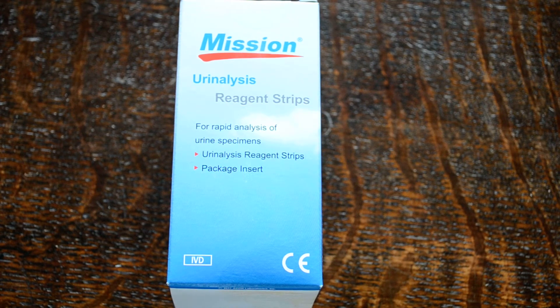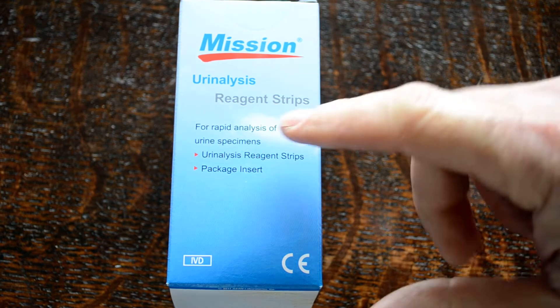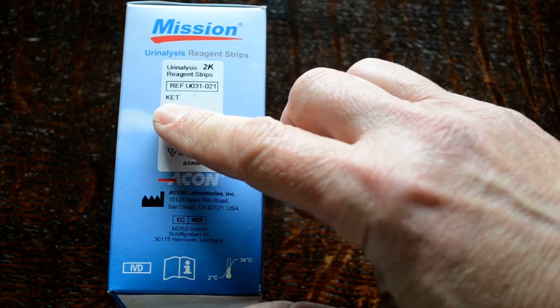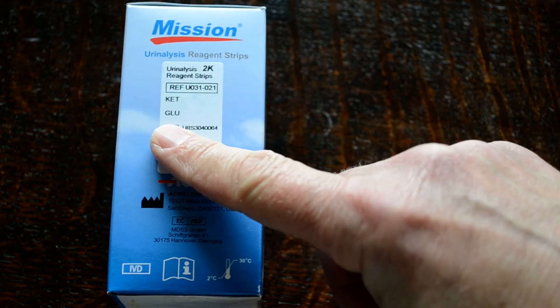Welcome to this video. We're going to show you the Mission 2K product. This is a urinalysis dip test strip. It comes in the pack shown in front of you here. CE marked in vitro diagnostic, which means it's for human testing. This particular test strip is a 2K, which means it's got ketone and glucose on the test strip.